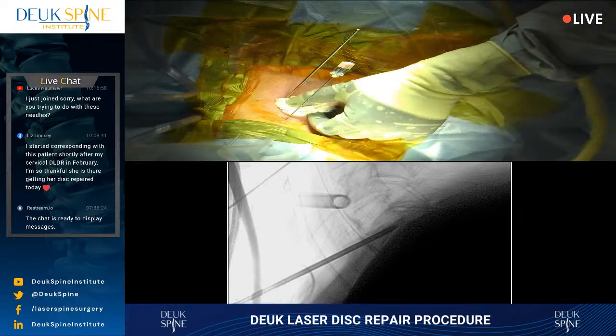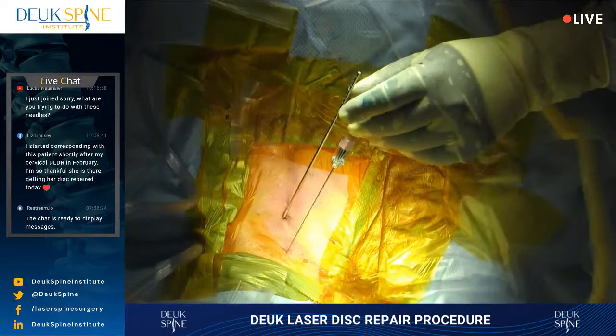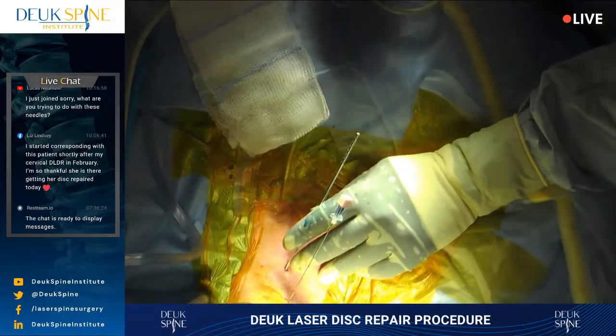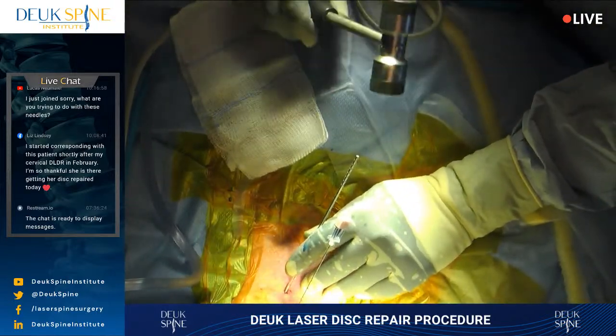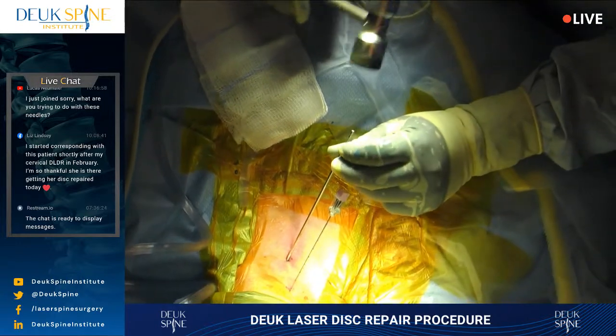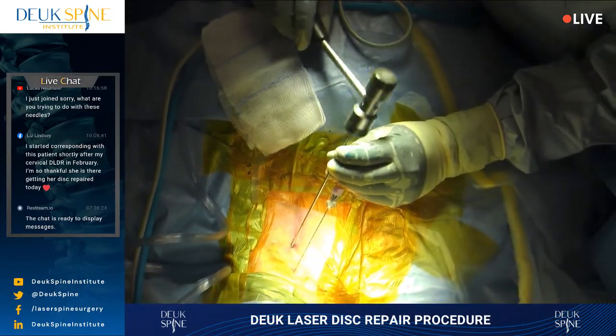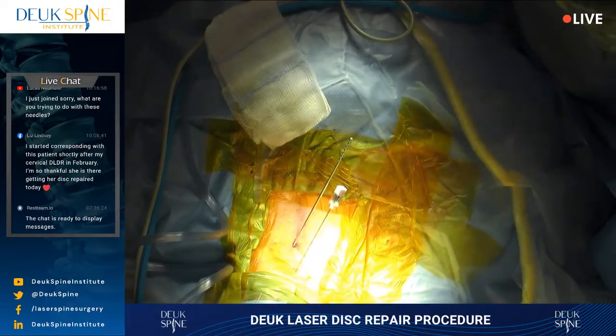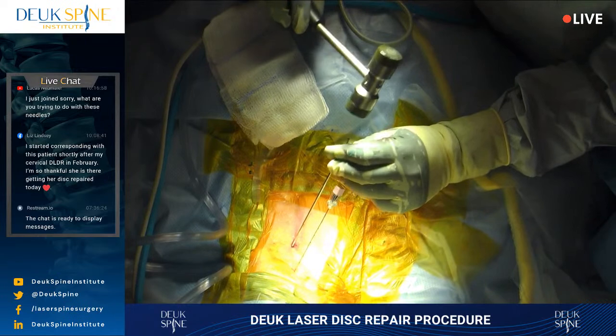And I know for most of you watching, you're thinking, well, if it's delicate, why would you use a hammer? And the answer is, with a hammer, you can actually control how much energy you deliver. And I can do that, and I can feel the advancement of this dilator. So it's actually safer to use the hammer, much safer.